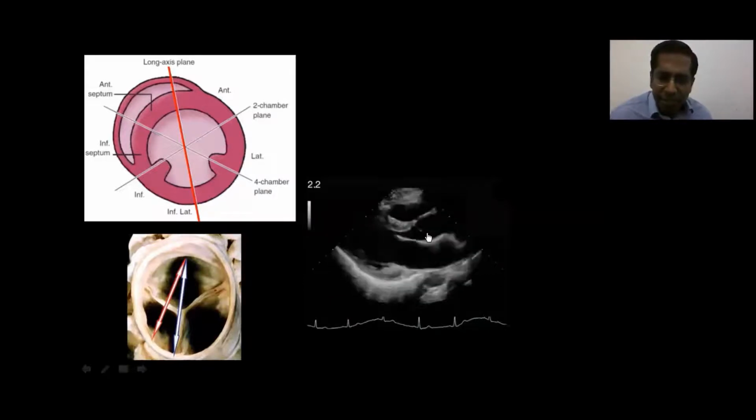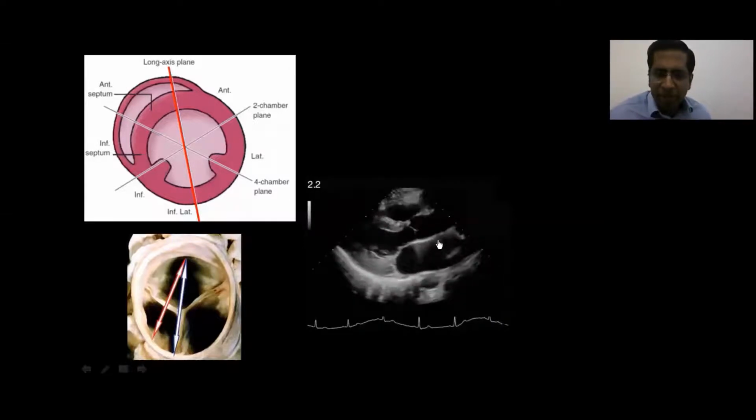It is certainly a feature of bicuspid aortic valve, and since that is a common thing in everybody's mind, it is important to be sure that the plane in which we are cutting the parasternal long axis view is in the center and not off center. Once it is off center, then we cannot be sure about the closure line of the aortic valve. And even if we put an M mode here, that doesn't have much value, because what we will see on the M mode is also what we see in the 2D here. So that is about the planes.